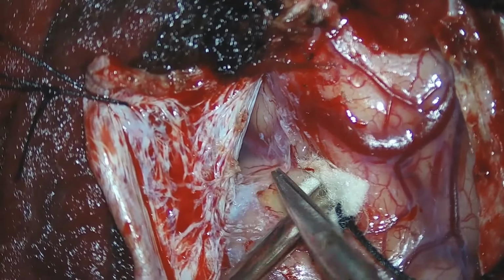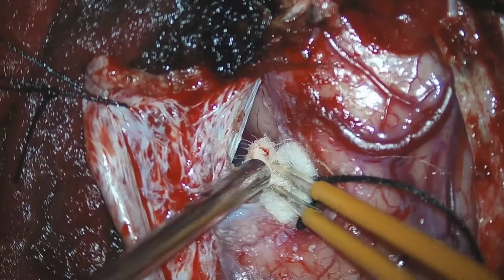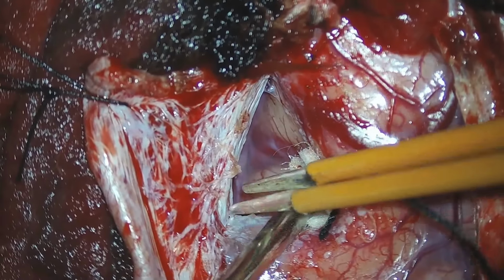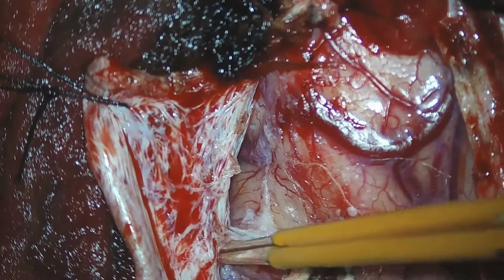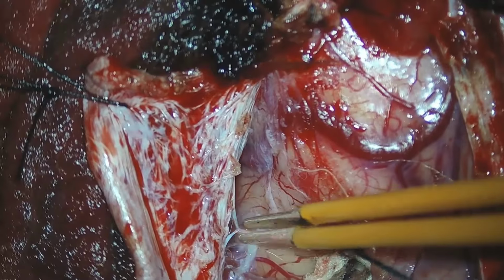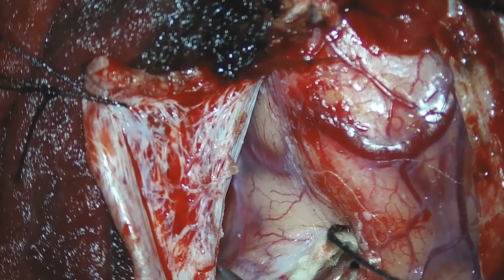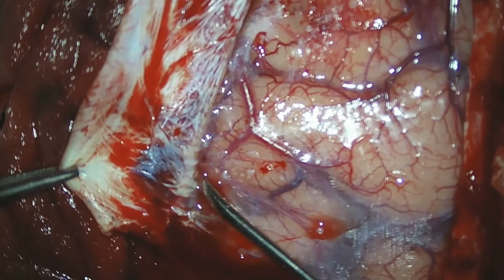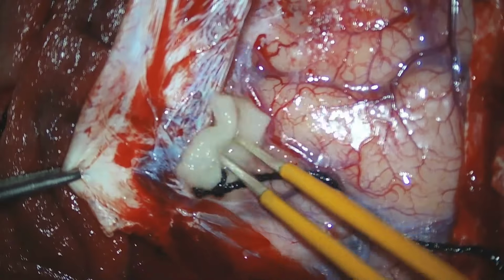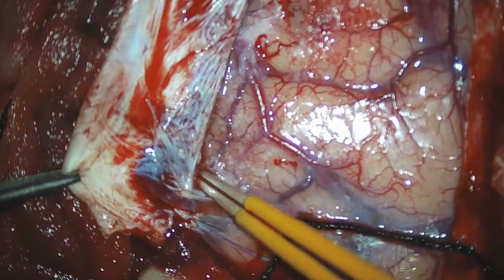Only small windows are possible whenever there are multiple draining veins into the superior sagittal sinus. Here, luckily, only adhesions were seen. There are no large veins draining into the superior sagittal sinus. Now we can carefully dissect the gap in the interhemispheric area and enter it.